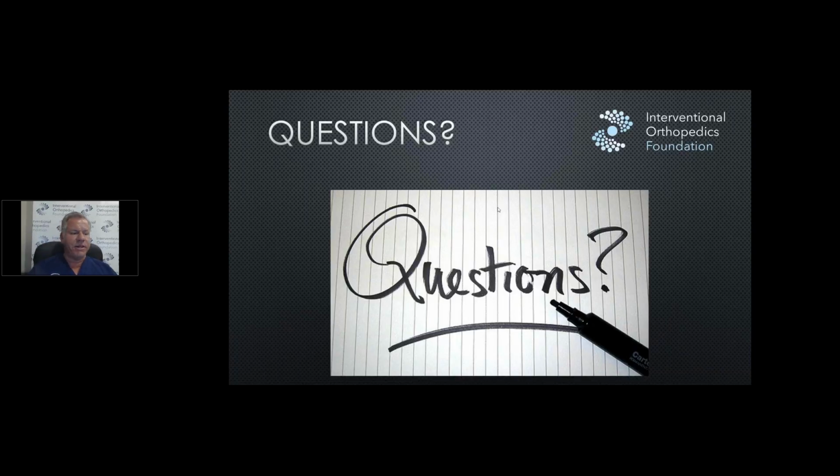Now, on the sagittal images, I wish I could just open up a viewer here. My concern with opening up a viewer is I'm going to show you a patient name, but the bottom line is the way to do it is just to have two windows open. So first, I'd get that Radiant software that I talked about earlier in the talk, because that's a good one.